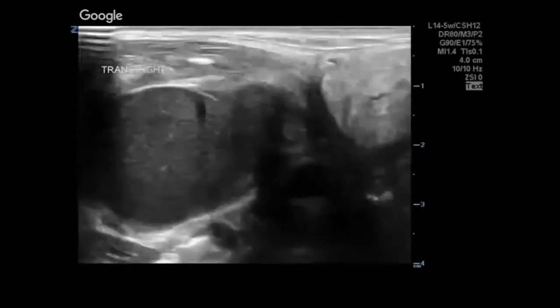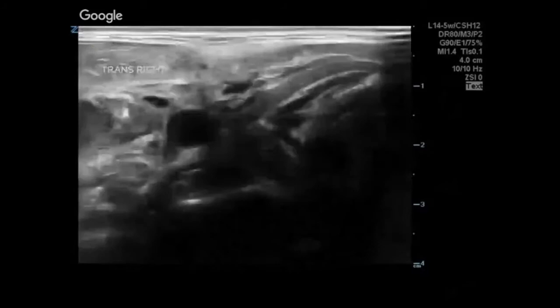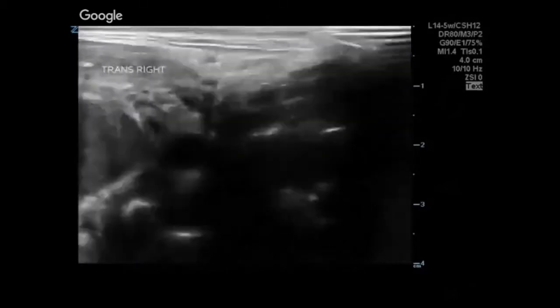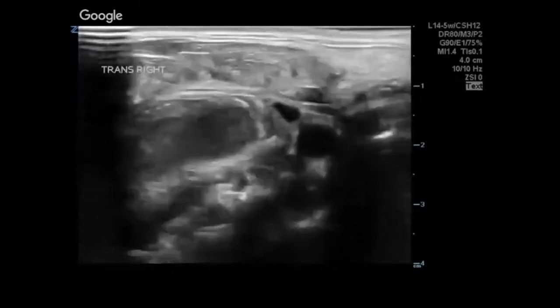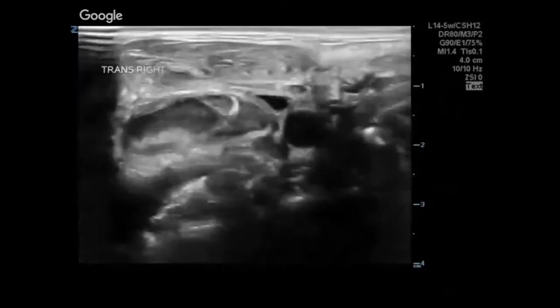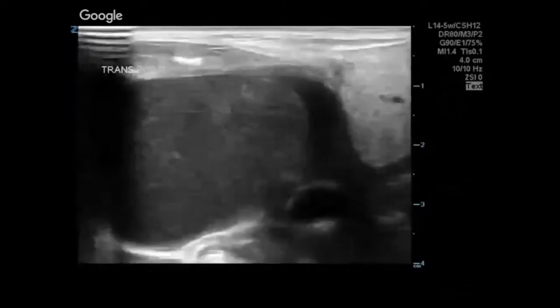Exactly, but as Mark taught us to say, we need to say collection, origin unclear. So under this kind of definition, origin unclear. Like we decided, we're going to divide our neck masses according to the way we're going to manage them. So if we think it's a lymph node, we would say lymph node no collection, lymph node with collection, or lymph node suspected malignancy. Something that Mark made up for a research issue, but it makes sense to me.